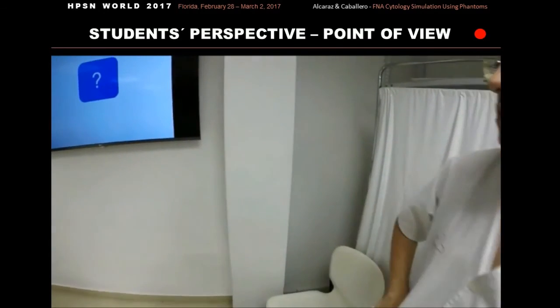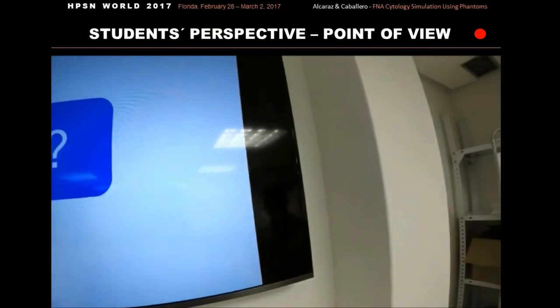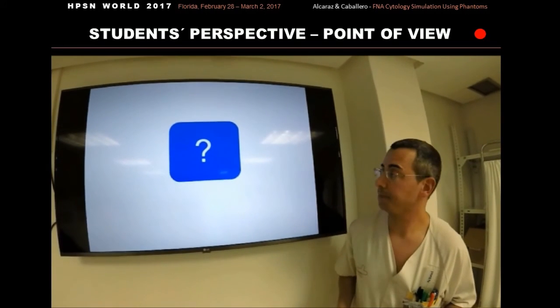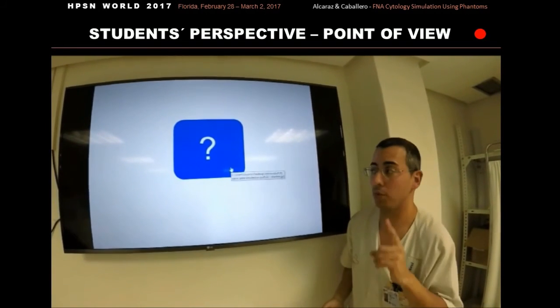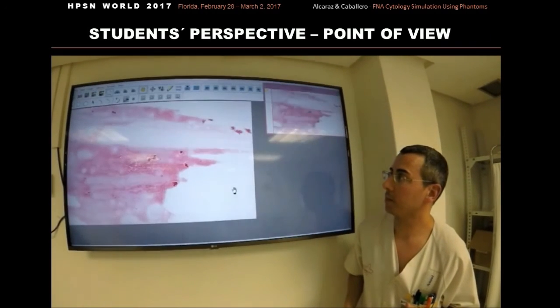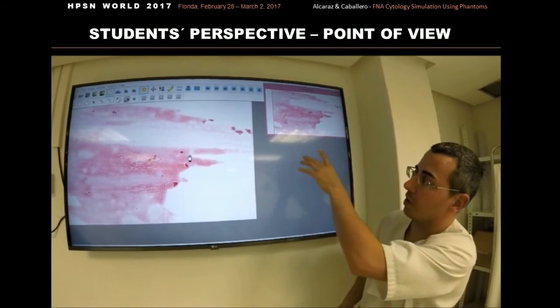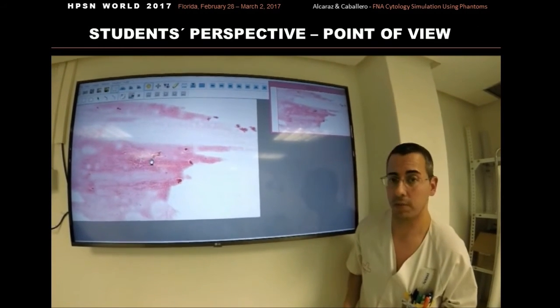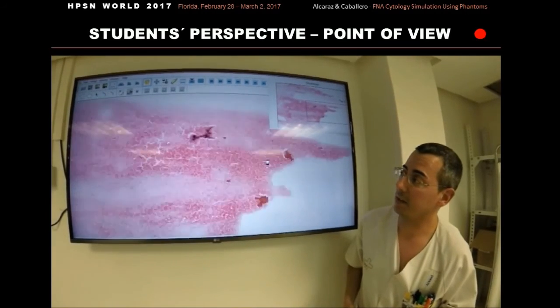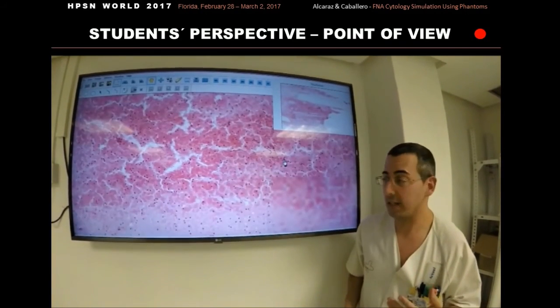If we have 7 students, we have 7 procedures, and the rest can watch what the others are doing. In this moment, the instructor explains the microscopic results. They have to rule out benign or malignant diseases, or even metastatic disease.